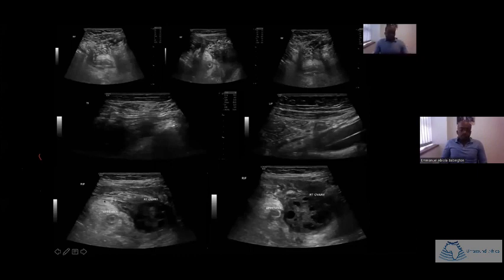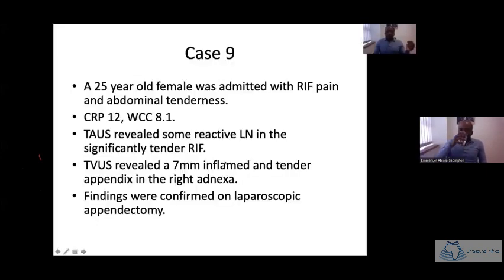And here again, we go down into the pelvis now. Everything was quite clean. We could use the 9 megahertz linear transducer to image the pelvis, and here is an image of the ovaries with normal follicles. I can see the appendix just next to the ovary there, which might explain why the gynecologist anticipated a gynecological abnormality. But the ovary looks normal on ultrasound. So this is a case that also highlights the use of ultrasound in examining the appendix and the bowel.